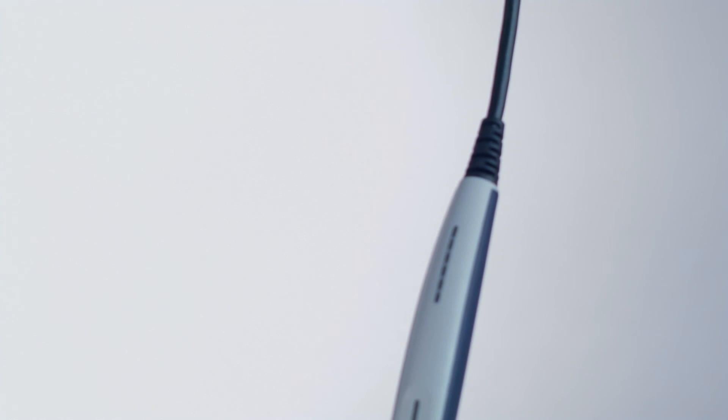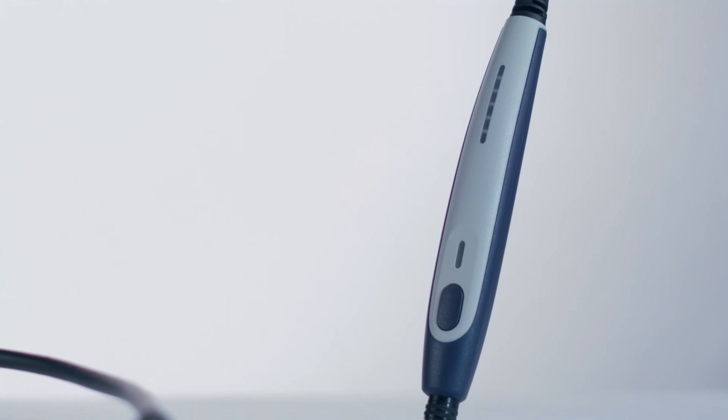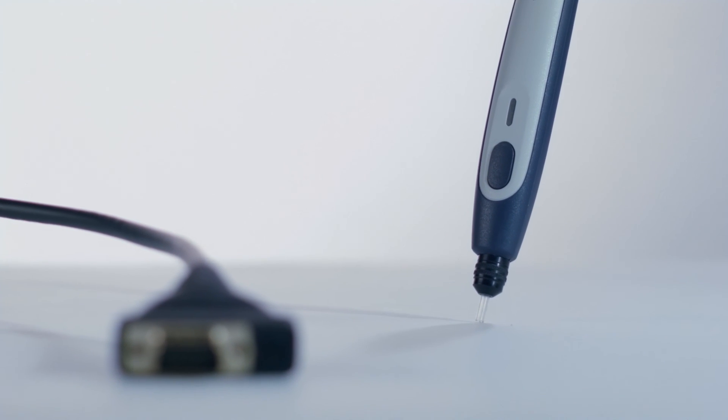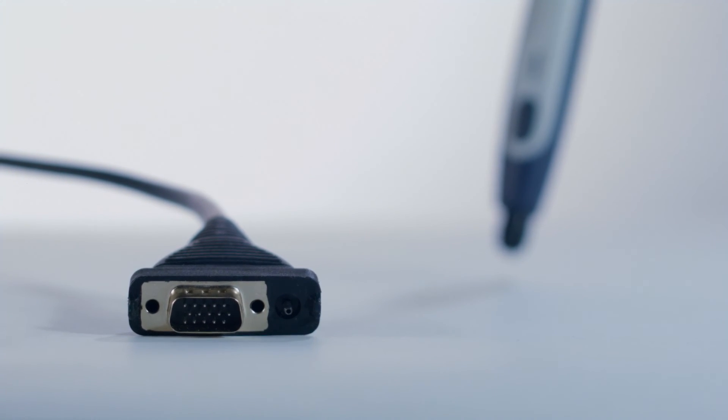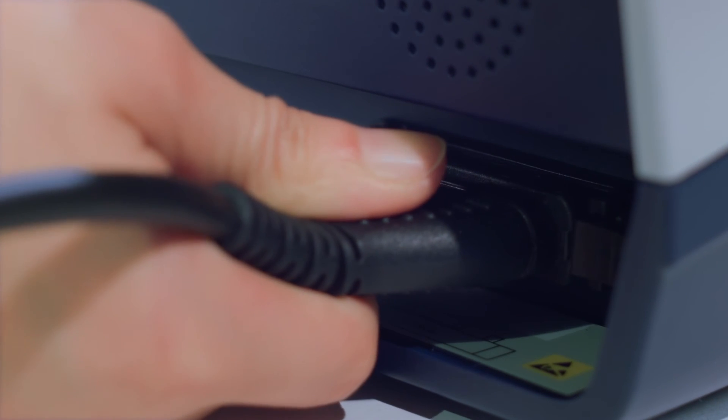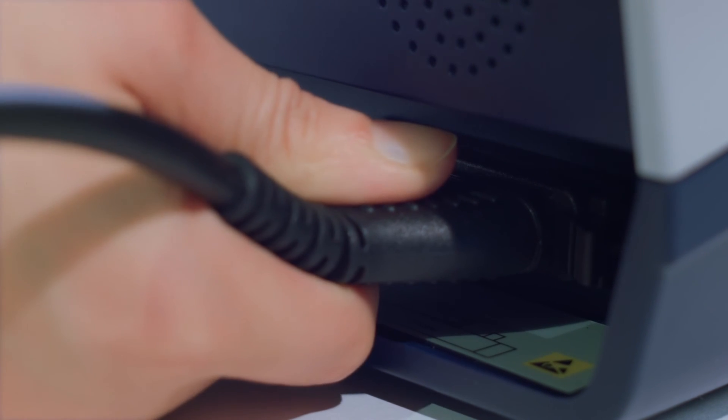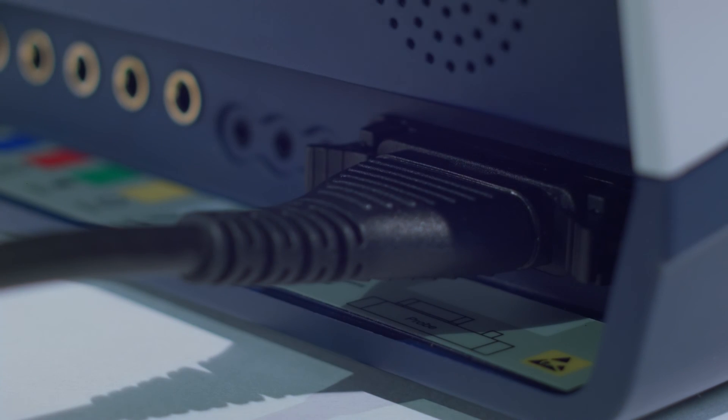The pen probe comes specifically calibrated for the base unit and can be used right away. Attach the probe by gently pushing the connector into the jack labeled Probe. The brackets to the left and right of the jack will close automatically and the probe will sit tight and safe.